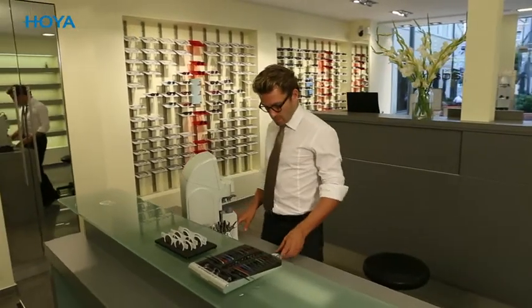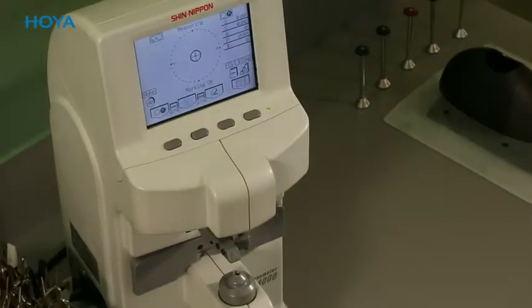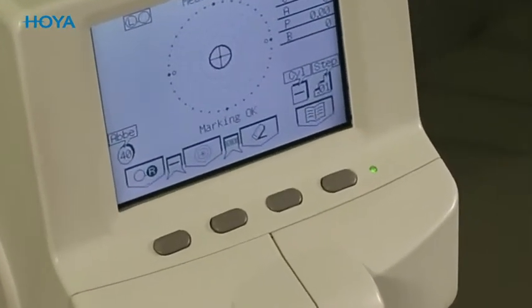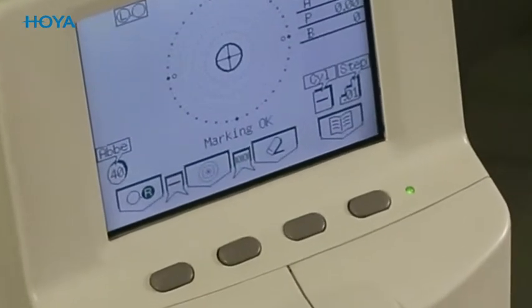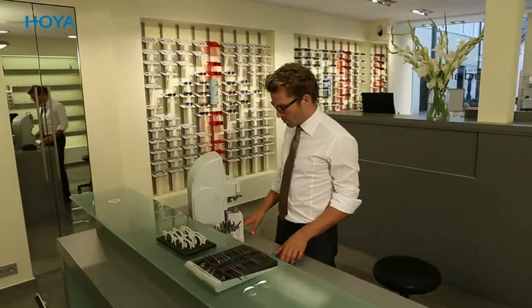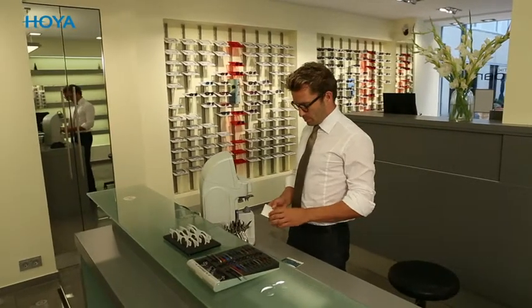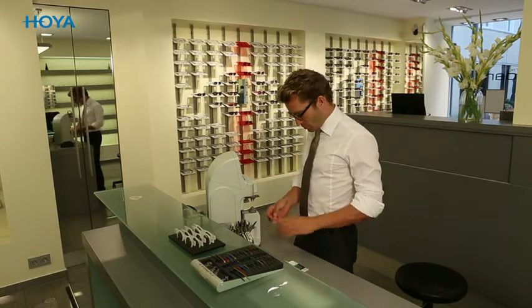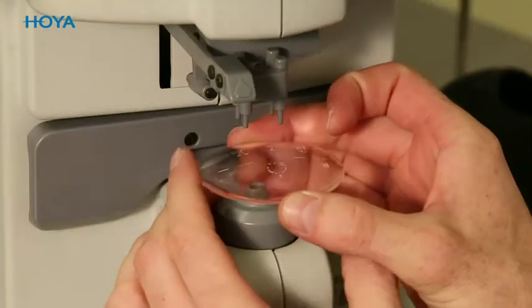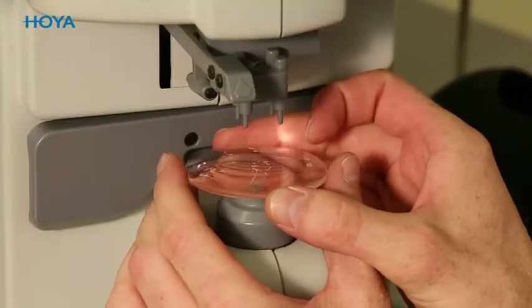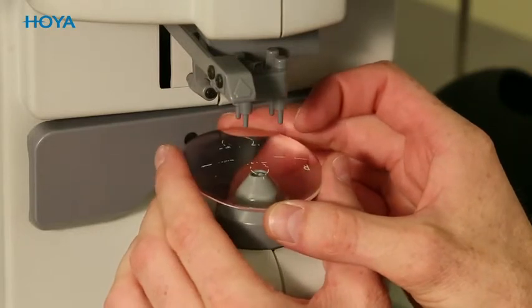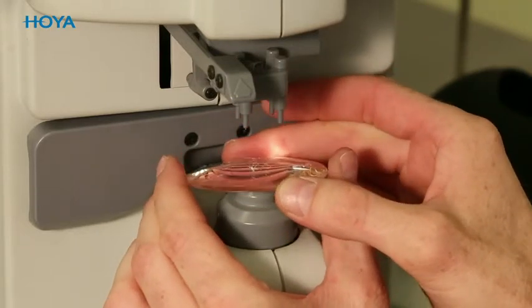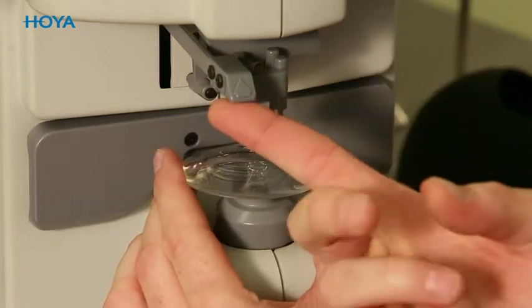When the lenses arrive in your shop, you can check the reference power by following a range of steps using a digital focimeter. First of all, make sure to calibrate your focimeter regularly to ensure correct measurements. Set it to manual and adjust the Abbe value. This is an essential step for all focimeters.